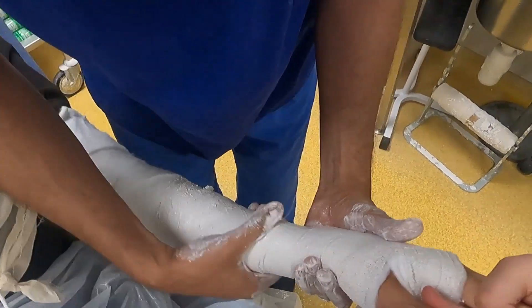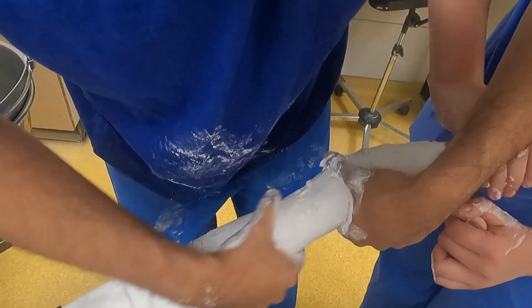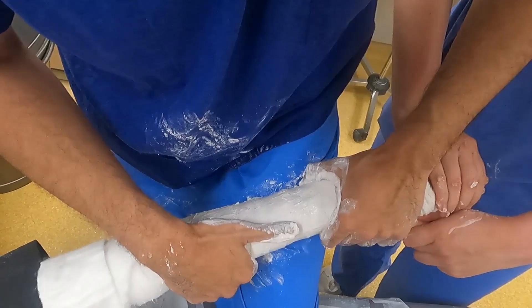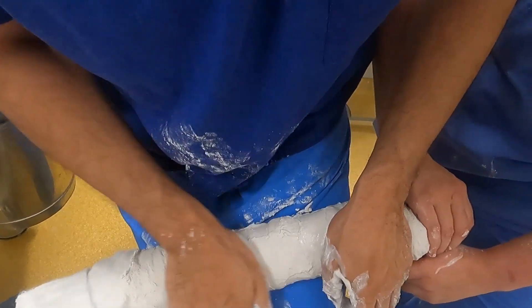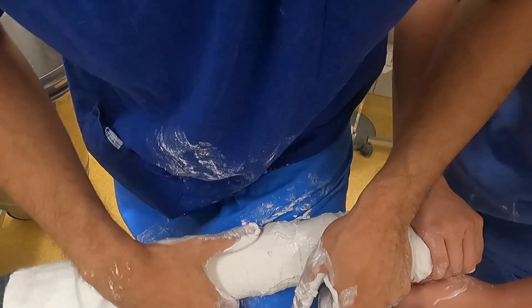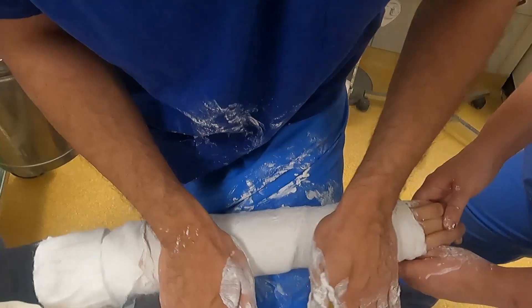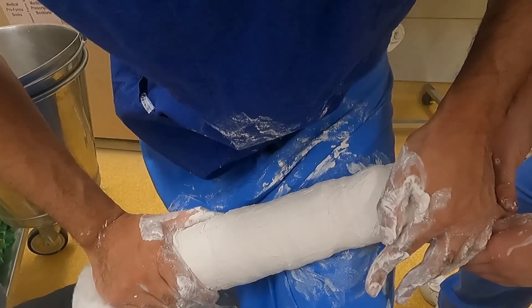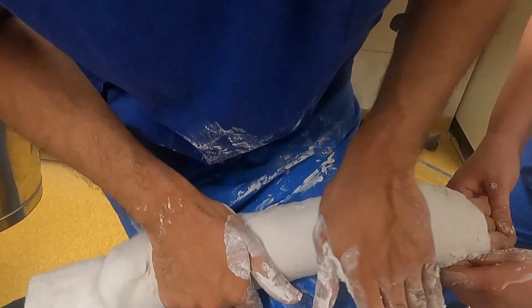There was no significant swelling given the low energy injury sustained in this case, which is why a circumferential cast was applied in the initial setting. Here, three-point moulding was applied, which is key to fracture reduction, using my knee as a fulcrum.